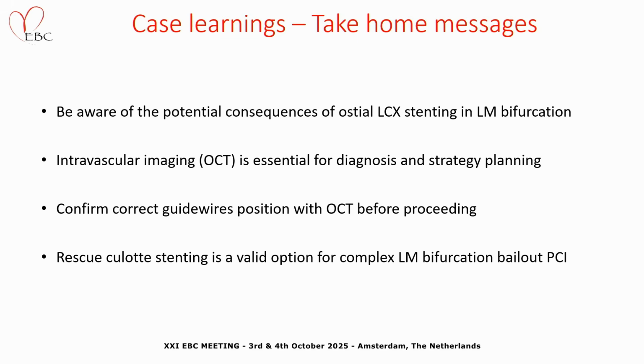So my take-home message is that, first of all, when stenting, in particular the left main bifurcation, in a hostile position, both the LAD and the circumflex, we have to be aware of the possible consequences we may encounter if we are not precise or if we can't be precise.